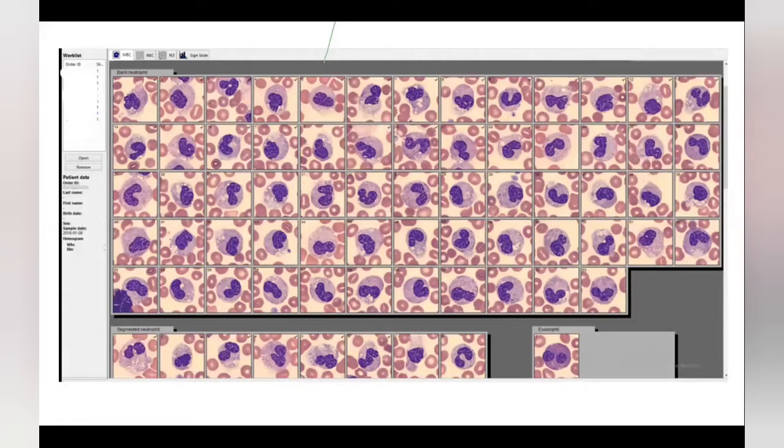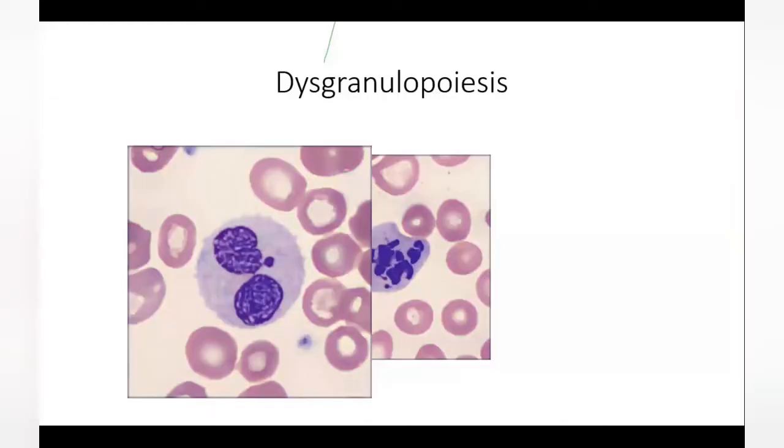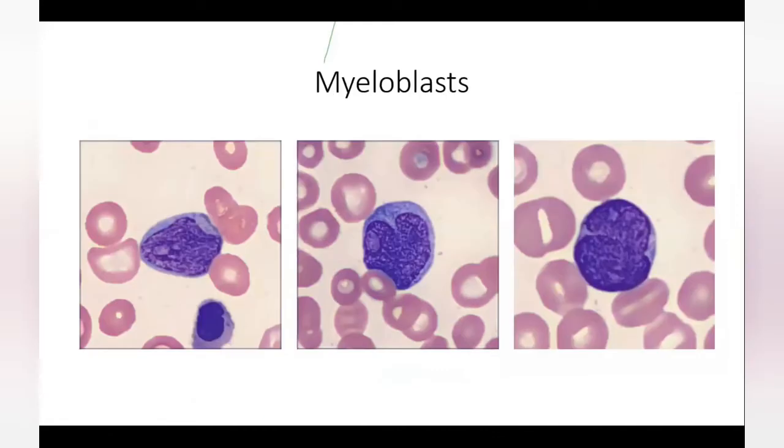So when we saw this on the image analyzer, the neutrophils looked, first of all, and look at the number of lobes, they're all band forms. They're all looking like pseudo-Pelger-Huet kind of cells. The cytoplasm is pretty much washed off. There are hardly any granules. They're perhaps even smaller in size. Obviously, there was dysgranulopoiesis, and there were occasional abnormal-looking cells, and some of these were myeloblasts, very occasional, but they were there.